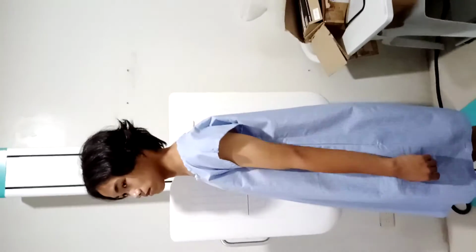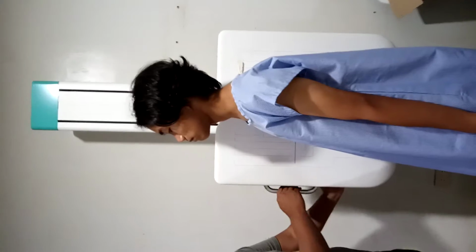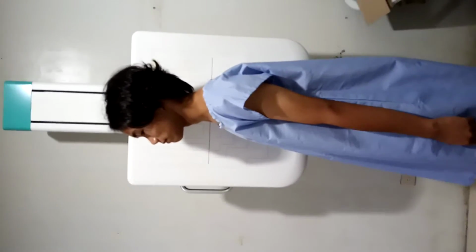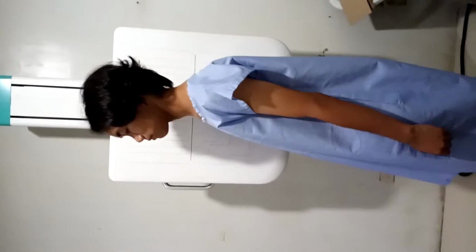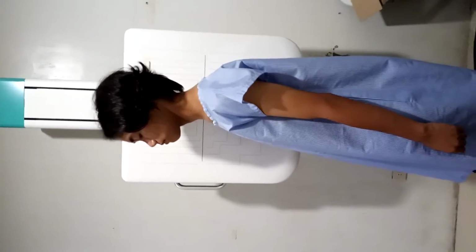Then have the patient elevate the chin slightly. Elevate the chin slightly, sir. And relax the shoulders, sir. Relax your shoulders. If necessary, attach weights to the wrists to help lower the shoulders. Then always remember to shield the gonads before exposing the patient.